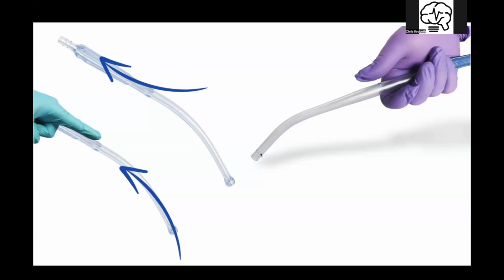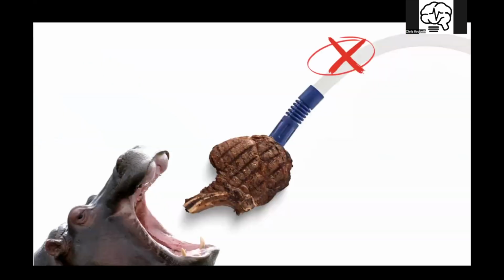This is the one you need on the trauma patient, the person who's now starting to vomit up the number two supersized with fries they just ordered prior to coding. This is the one that gets a lot of stuff up and out. I can tell you personally, I have had to go after large pieces of food that were sitting proximal in the airway. I actually just took the whole catheter tip off and used the end of the suction tubing to go in and plunge. Now, you don't have that hole there, so if you put this in and it catches the cheek, you're going to start sucking the cheek.